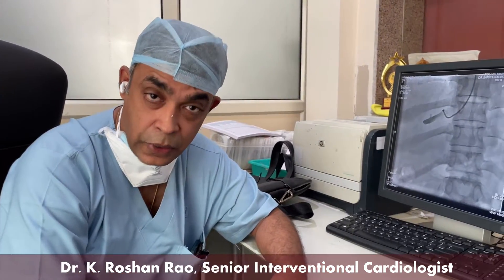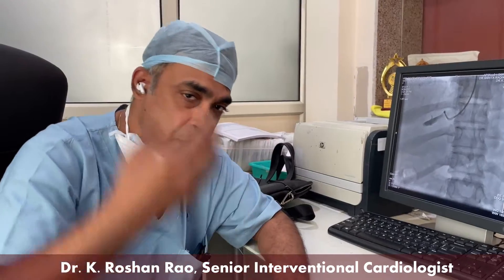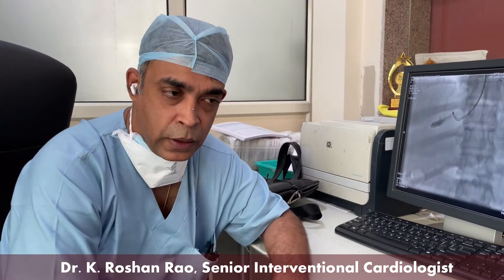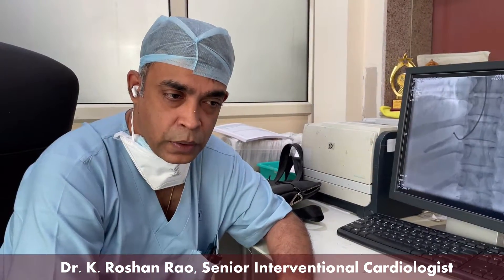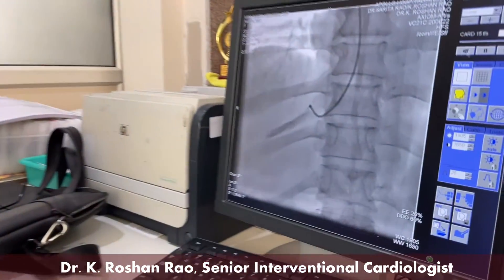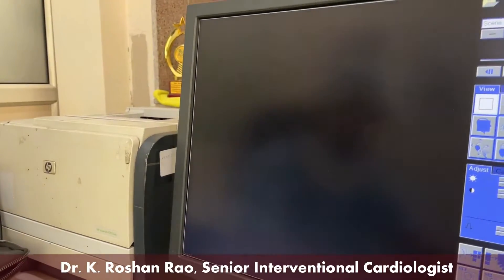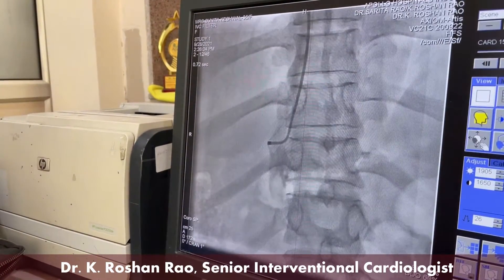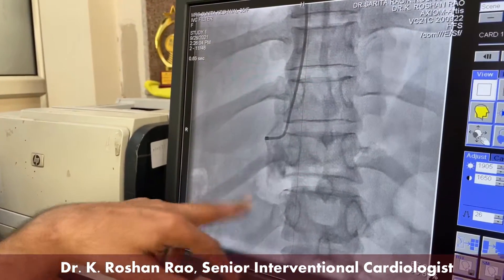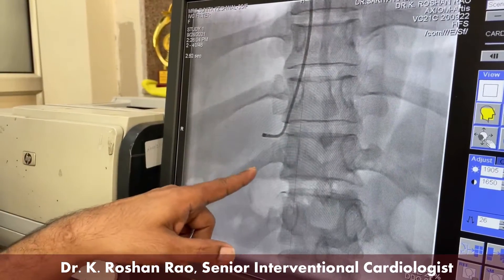We took a retrievable IVC filter that could also be implanted from the upper approach, that is via the jugular veins. This is the basic video — this is the hepatic vein, and you cannot see the renal vein here. This is the rib; the renal veins are just below the ribs, this is probably the 10th rib.